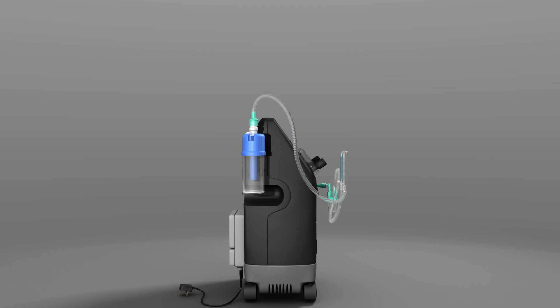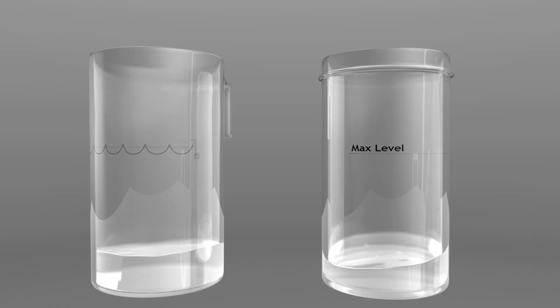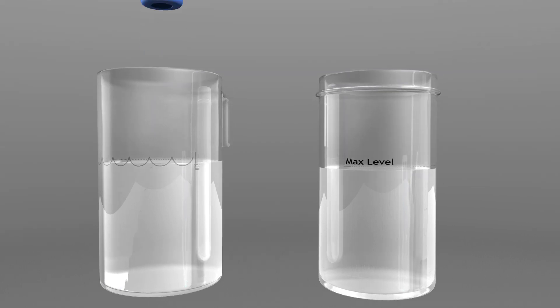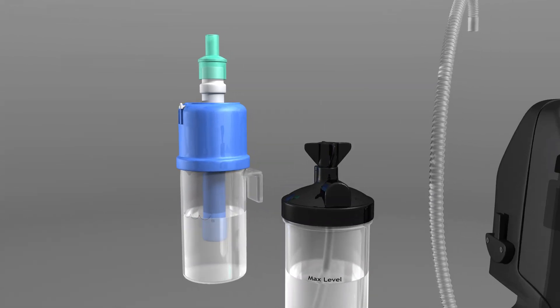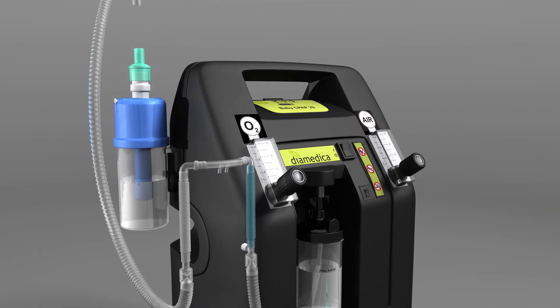Position the CPAP at least 30 centimetres away from walls or curtains so that the air inlet at the back is not obstructed. Fill the bubble bottle and humidifier bottle to the indicated level with boiled water that has been allowed to cool. Screw the lids back on, connect the humidifier bottle to the main gas outlet, and clip the bubble bottle onto the side of the CPAP.